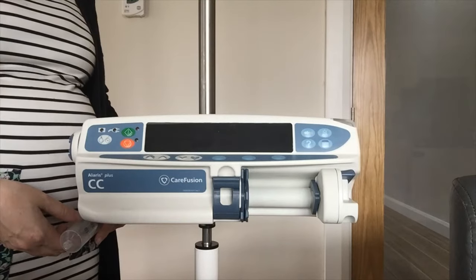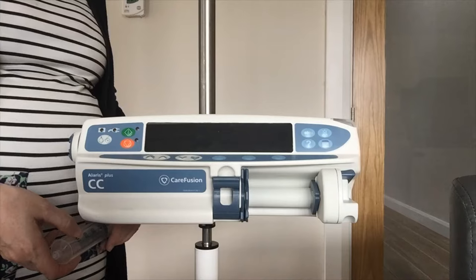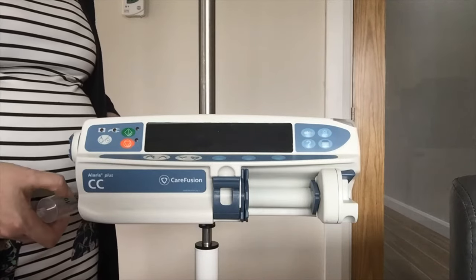BD Syringe Pump Training. For the purpose of this training I am using a CC syringe pump, but this training will also apply to your GH syringe pump as both pumps use the same platform.